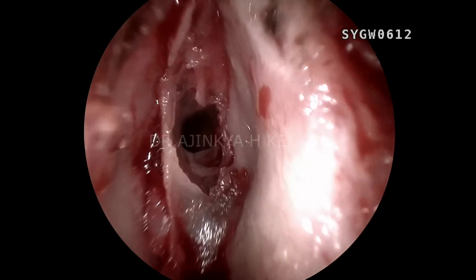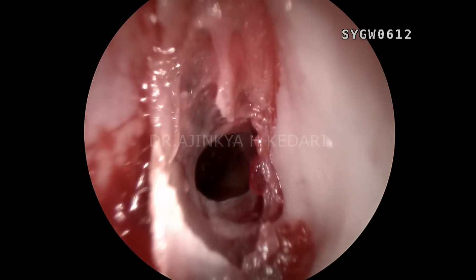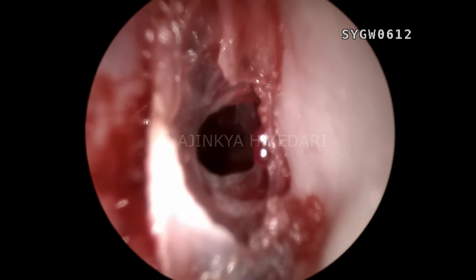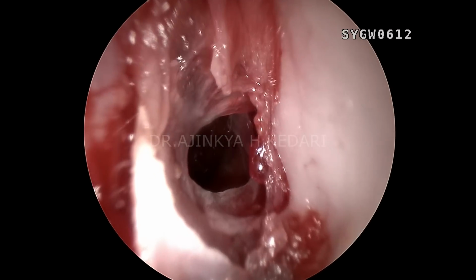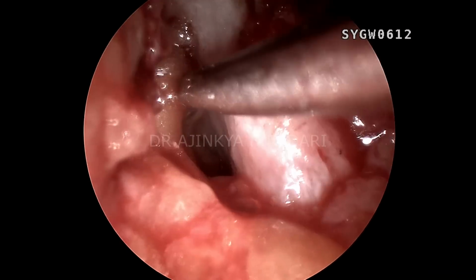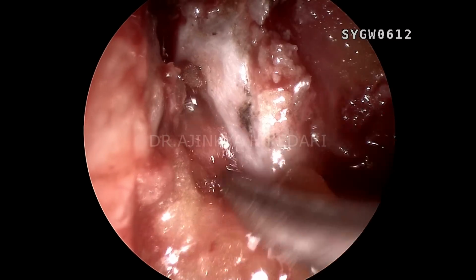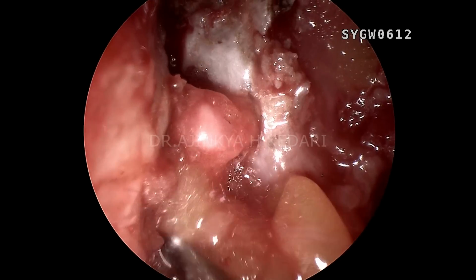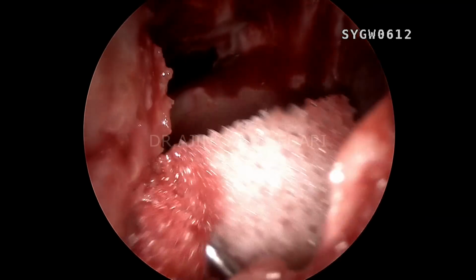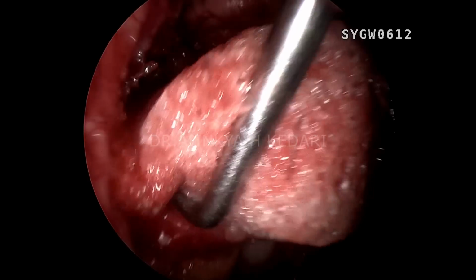So at your 9 o'clock is the orbit, and your 12 o'clock is the skull base. You can see that's the orbital skull base junction over here, and that is a huge skull base bony defect which you need to plug in with fat. Same technique, bath plug technique, or you can just plug in the fat, half in, half out, or you can say 3/4 in, 1/4 out. Make sure you do not plug a lot of fat, otherwise you're going to have a raised intracranial pressure inside.